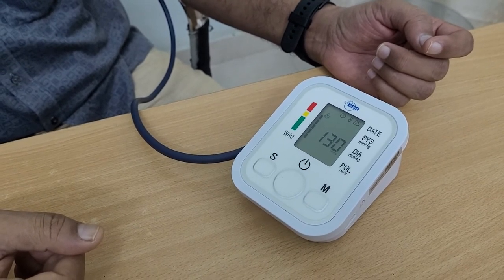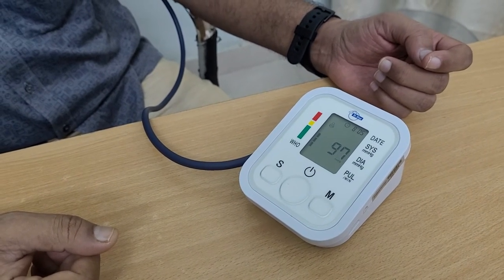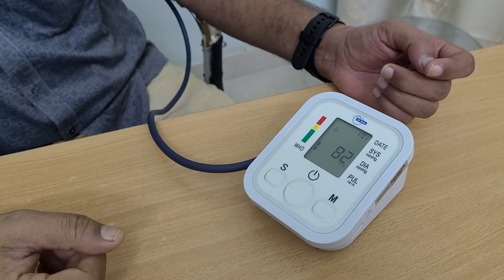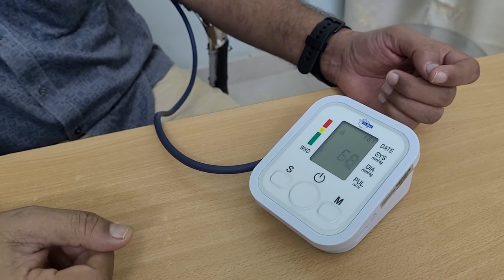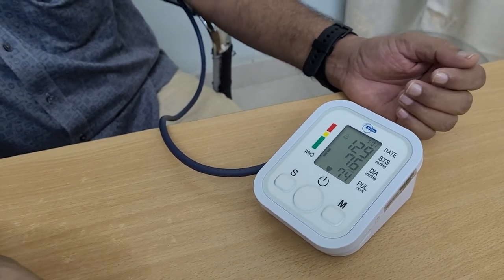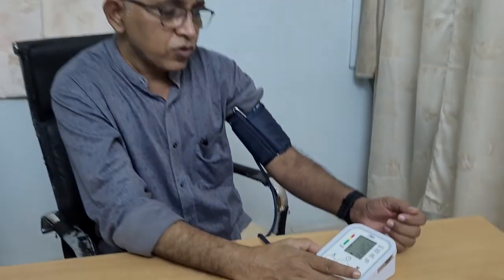It also gives a reading of the pulse, and both systolic and diastolic readings. These are the readings: 129 systolic, 76 diastolic, and 74 is the pulse. So this is ideal for self-monitoring.